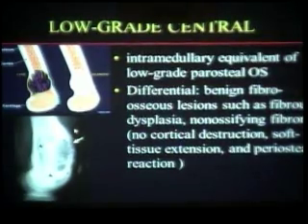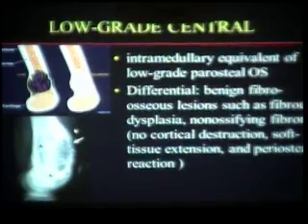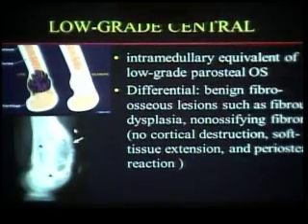This is the one that is my problem, the low-grade central, because they may simulate a benign tumor, like for example an NOF, or a prior fracture. So you see this lesion, I say, no, this is not aggressive, probably it's nothing, and then you follow up and you may have an osteosarcoma originated in this lesion. So this is my fear. I am always worried about missing this low-grade central osteosarcoma.